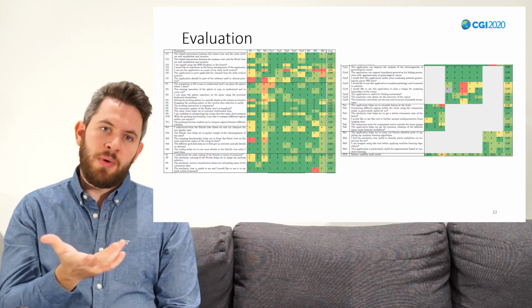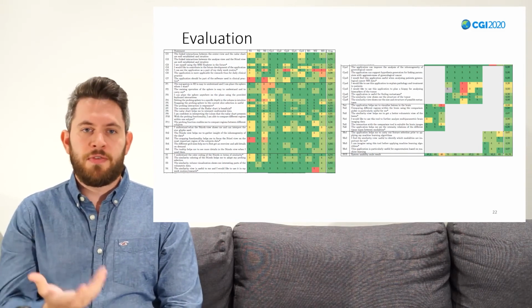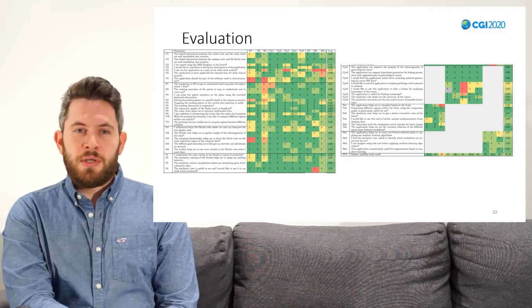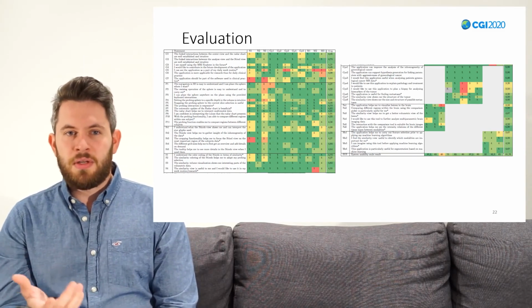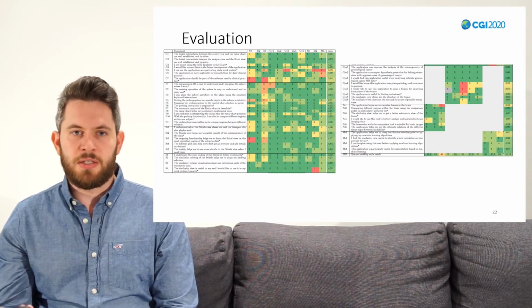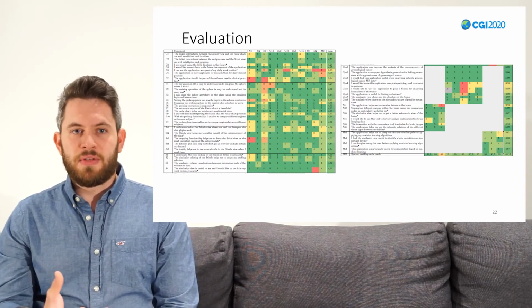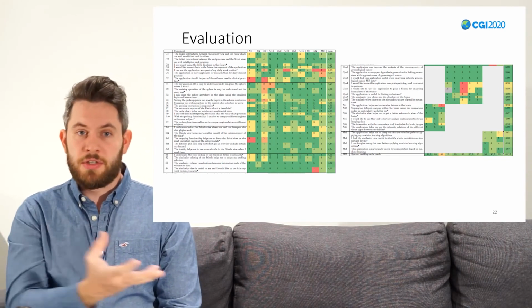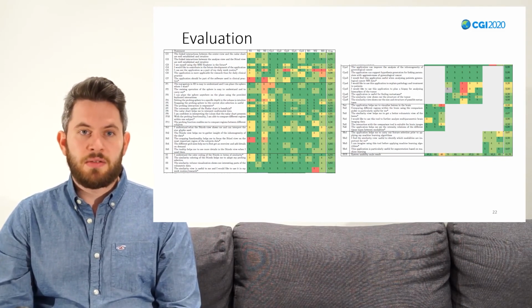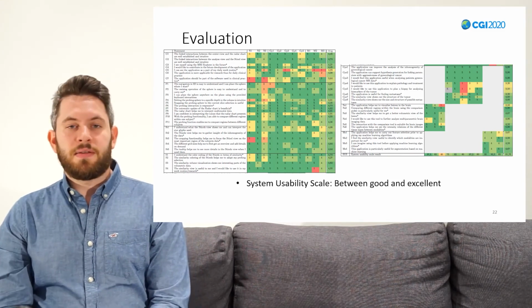So to give you more input on that, in a clinical routine, radiologists have to read images quite fast. It could be that they only have 15 minutes to read one data set of a patient, which is quite short. So for the application to be useful in the clinical routine, it either has to make their work quicker or it really has to have a benefit for the patient. And our experts don't know that yet. So we have to look into more detail if this is the case, and it could be that maybe some parts of our application go really to clinical routine. Yeah, and we also conducted the system usability scale to make our results comparable to those of others, and we got the result between good and excellent.